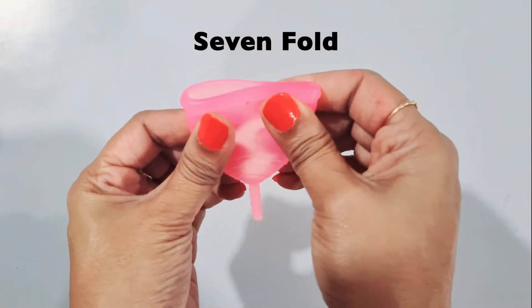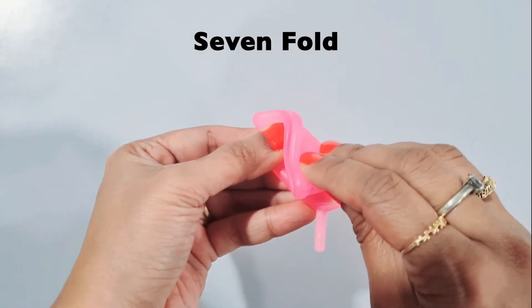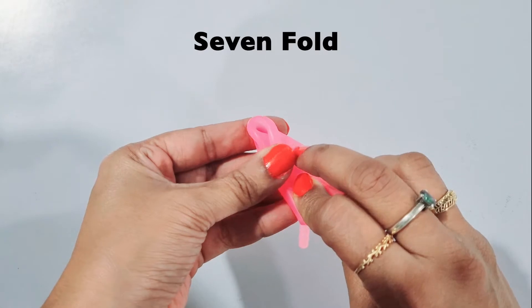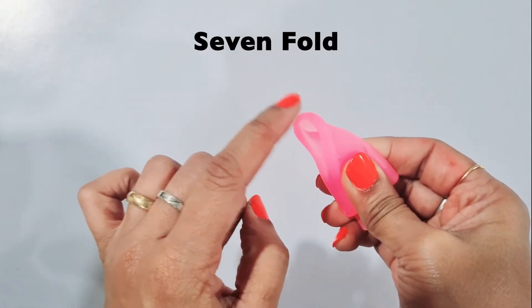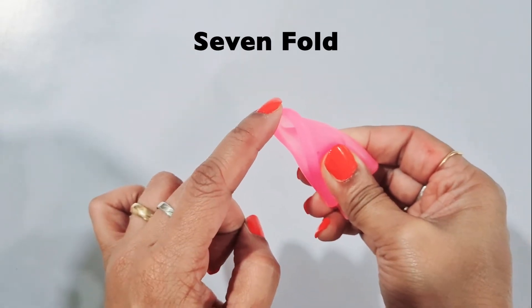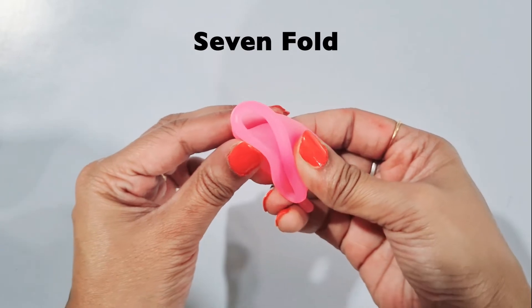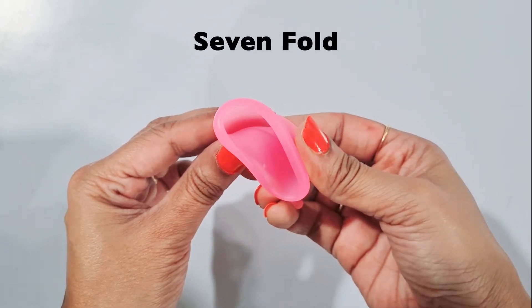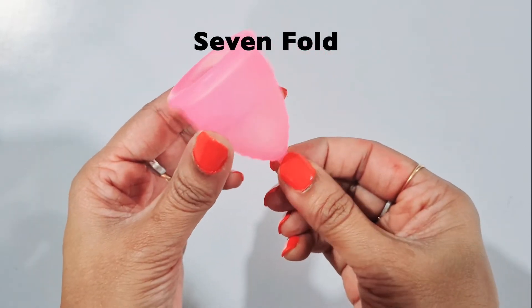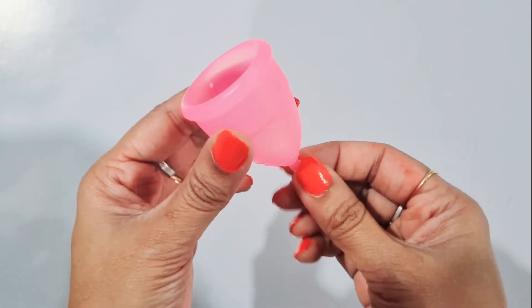The third is the 7 fold. Squeeze the cup and fold one corner to the opposite side or all the way down. This makes the point of insertion very narrow and is ideal for first time users. After inserting, the cup will automatically unfold, but if it does not, you need to hold the stem and rotate it from side to side and try pulling down a bit, adjusting as per your comfort.